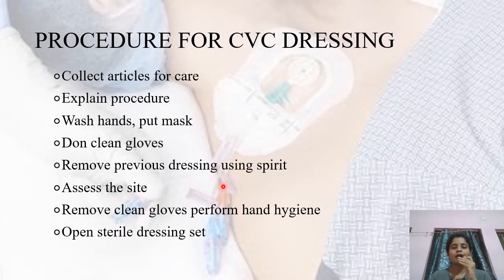All these things have to be checked while removing the dressing. Be careful and also look at whether the suturing securement of this CVC is done properly or not, otherwise it can get dislodged. So while removing the previous dressing you should be careful enough.